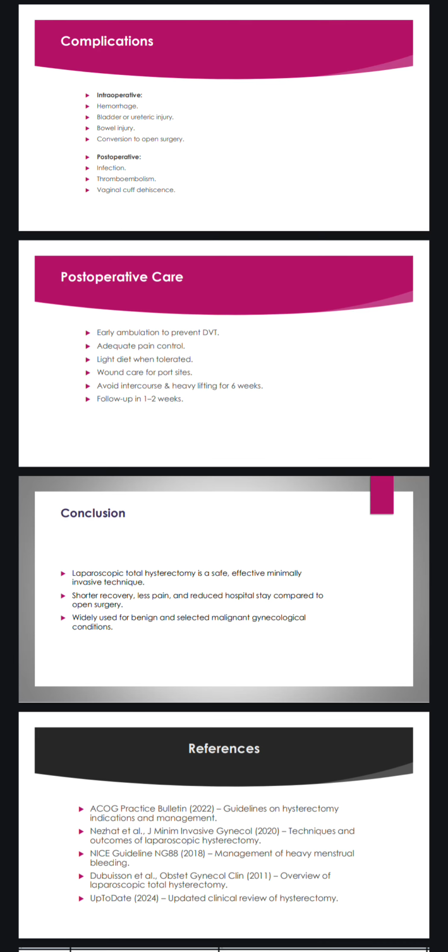And this procedure has intraoperative complications and postoperative complications. The intraoperative complications may include bleeding, bladder or ureteric injury, bowel injury, or conversion to open surgery. The postoperative complications include infection, thromboembolism, and vaginal cuff dehiscence.